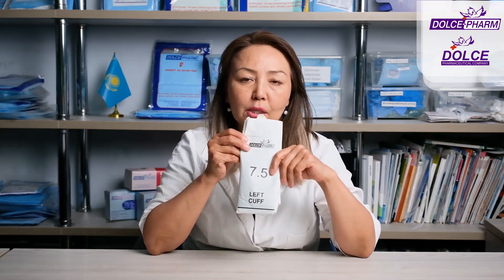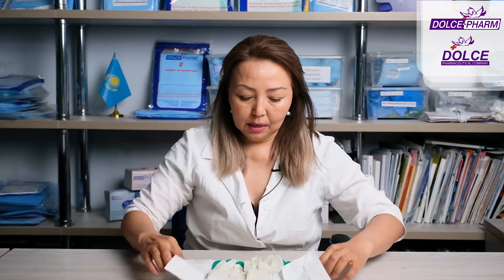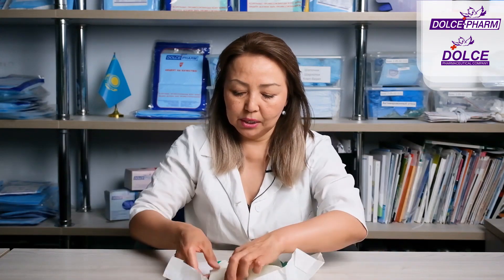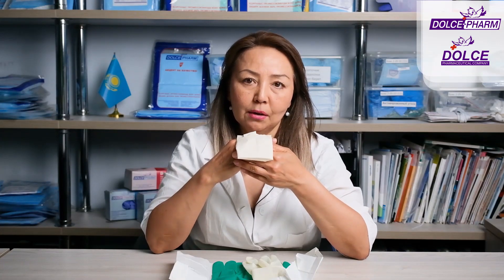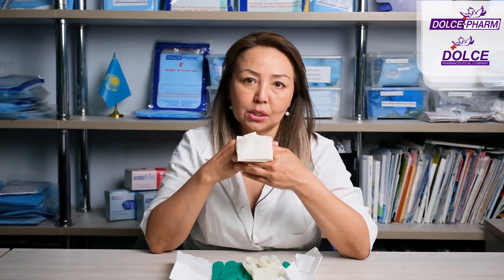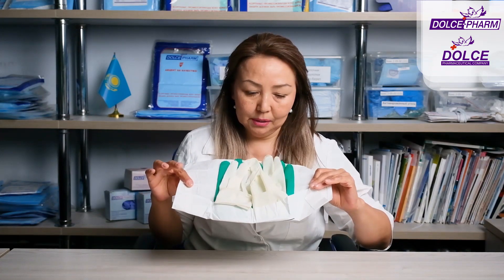This is what you'll find inside the packaging — the size is written here. Notice how the medical gloves are packaged. Sterile medical surgical gloves have the cuff turned out, which is critical because the surgeon puts them on first, and only then the cuff is unfolded on the hand to maintain sterility. Inside the Surgical Double package, you'll find four gloves: two colored and two white gloves.